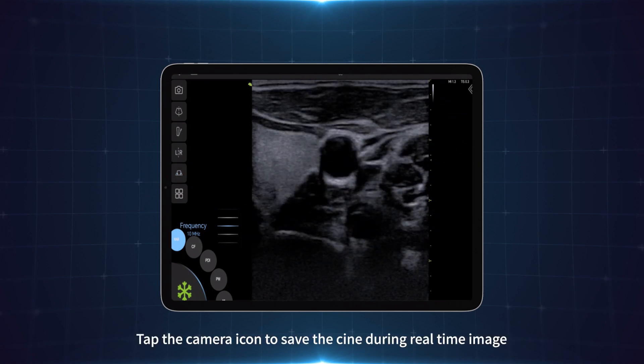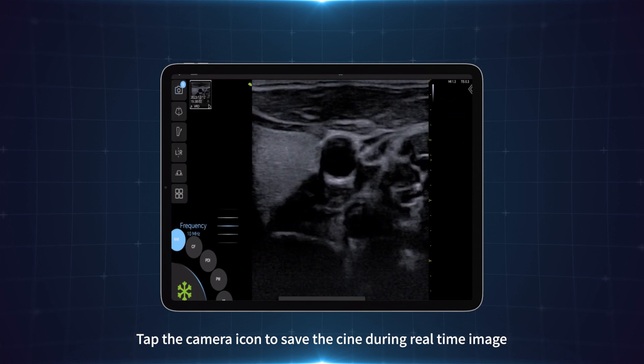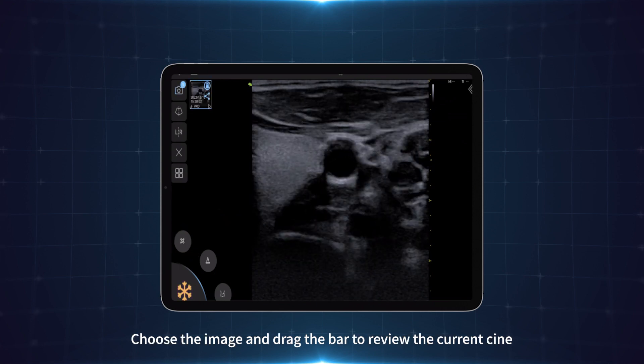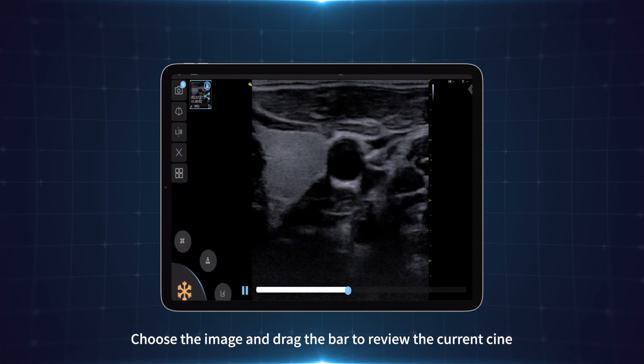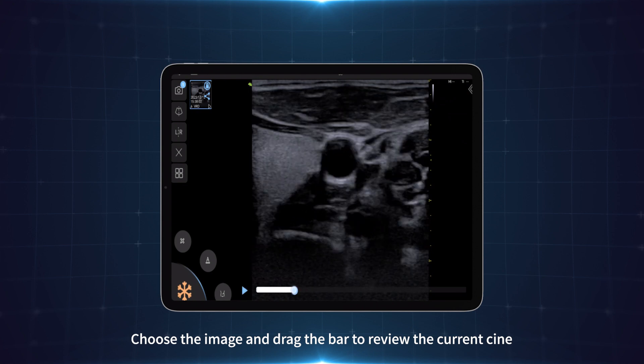Tap the camera icon to save the cine during real-time imaging. Choose the image and drag the bar to review the current cine.